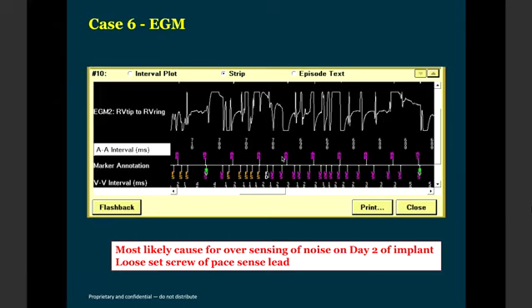If somebody has only a VF indication, no bradyarrhythmia problem, no atrial tachyarrhythmia issues, and has cost concerns, I will put in a single chamber ICD. You want to add something to that, Mukund? I agree with you, sir.